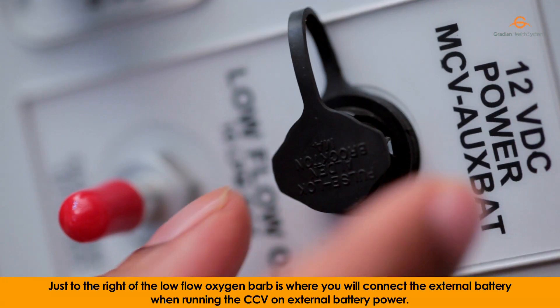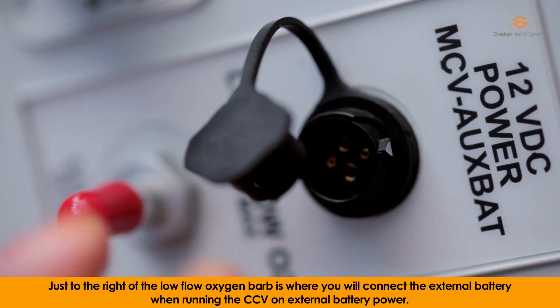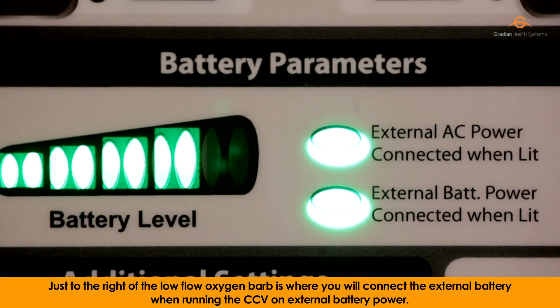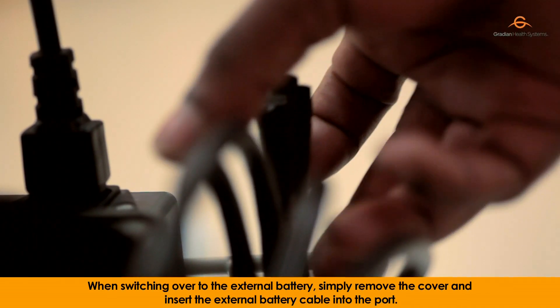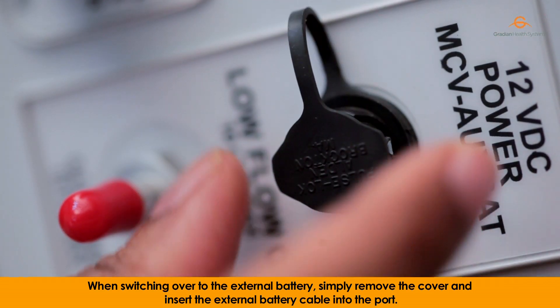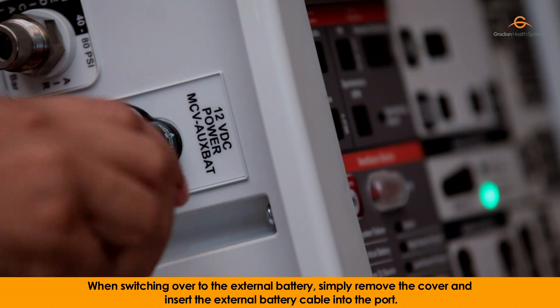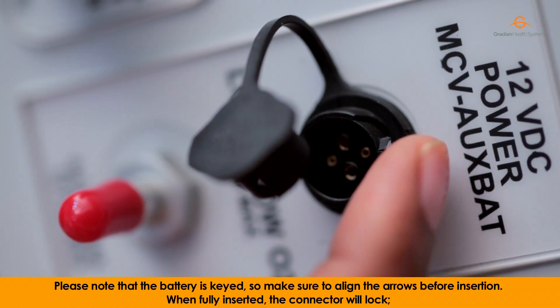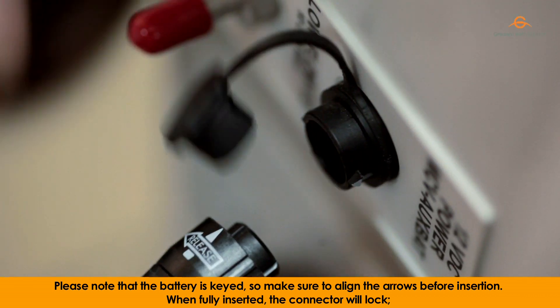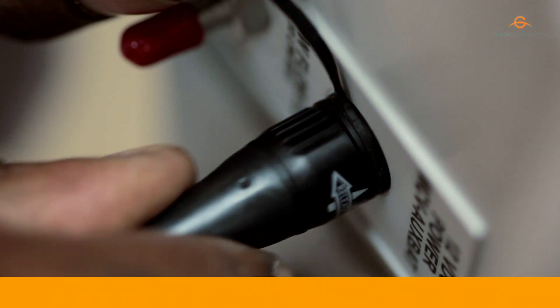Just to the right of the low-flow oxygen barb is where you will connect the external battery when running the CCV on external battery power. When switching over to the external battery, simply remove the cover and insert the external battery cable into the port. Please note that the battery is keyed, so make sure to align the arrows before insertion. When fully inserted, the connector will lock.